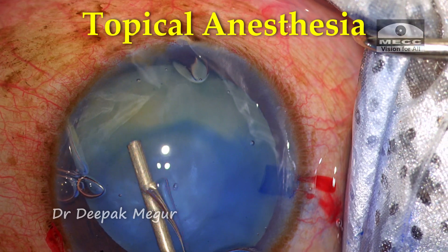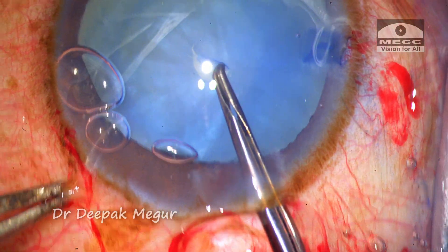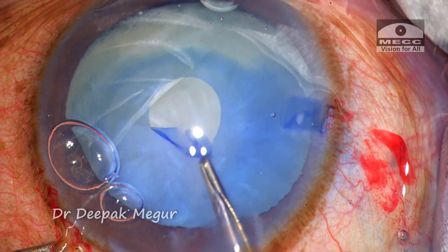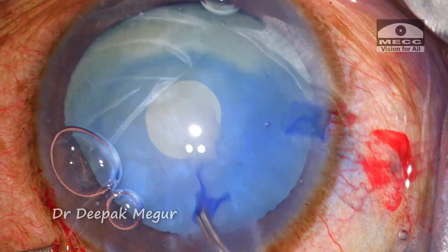The patient is comfortable with topical anesthesia. The anterior capsule is punctured with a 26-gauge needle and I intend to make a very small primary rhexis as part of my plan for a two-stage rhexis. The intralenticular pressure is too high in this patient, and I end up having a very small rhexis.